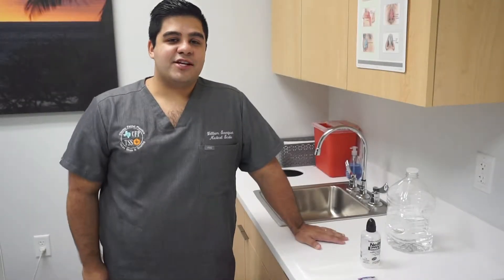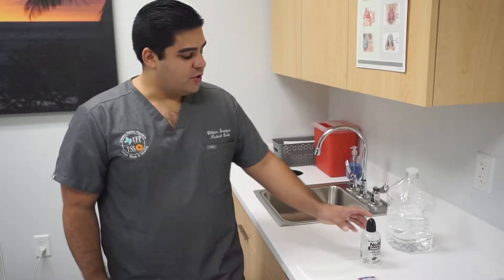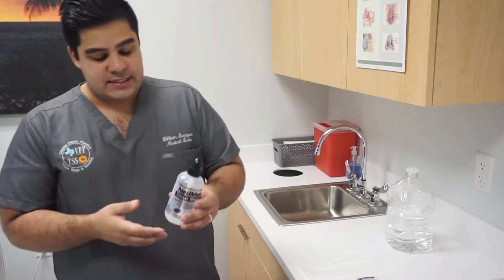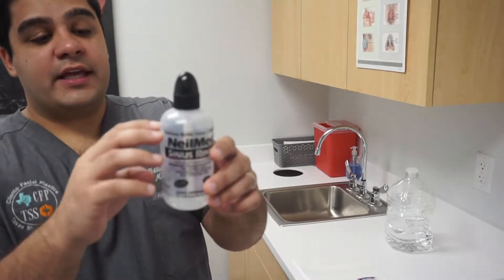Hello everybody. Today, under the direction of Dr. Cilento, I will be showing you how to use the NeilMed squeeze bottle. As you can see, this bottle has a fill line right here.